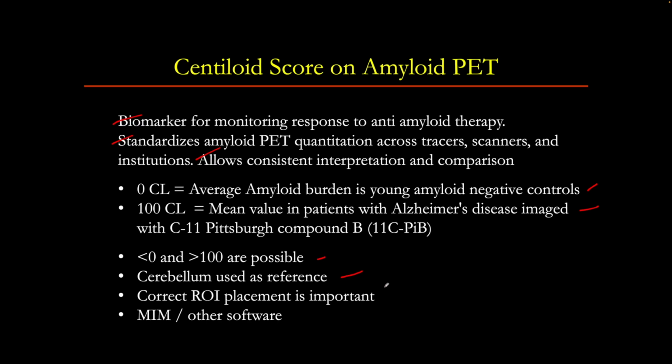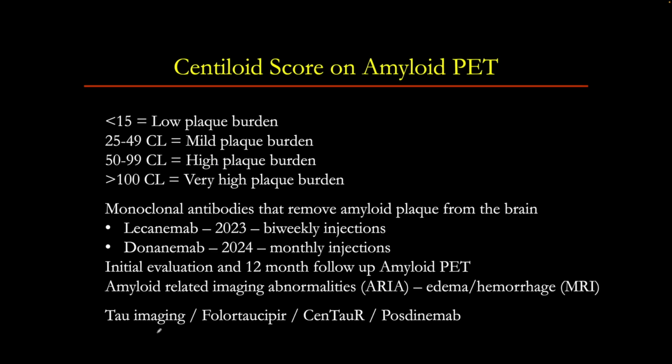Cerebellum is used as a reference. Correct ROI placement is important. I will show you an example later. And you can use a software such as MIM or some other software to calculate the Centiloid score on amyloid PET scans. So this is how we report it.